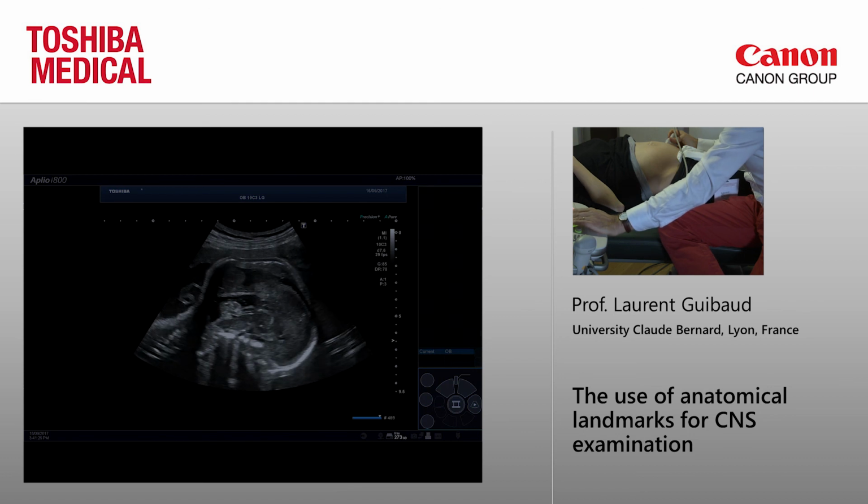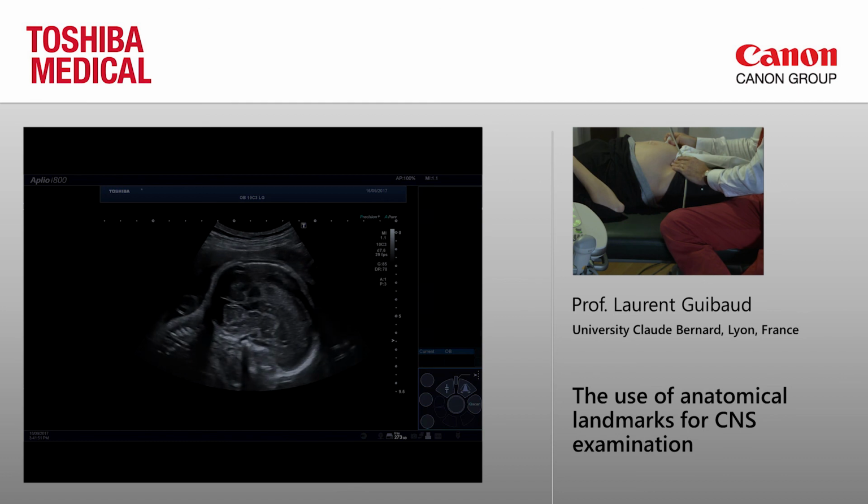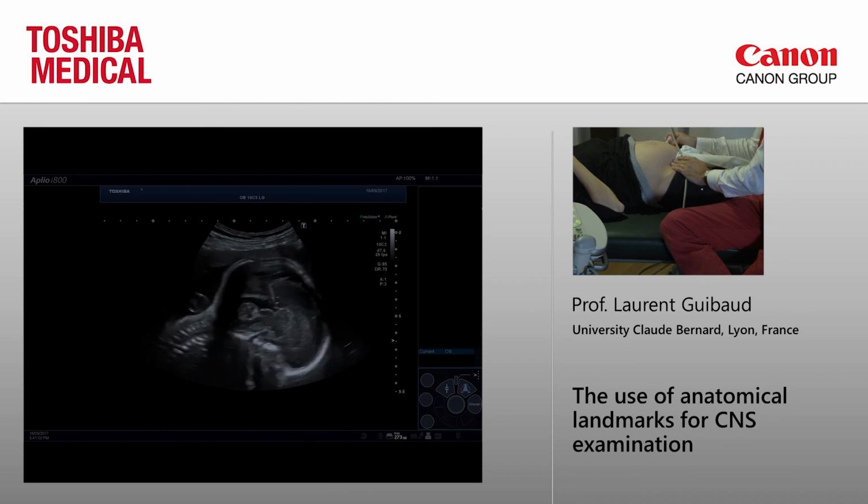Okay, this is the vermis. You see a perfect vermis, and you may also see this, which is the aqueduct. Here you have the pons, the bulb of the pons. You have the tentorium, which is here. And if you look, the echogenicity of the vermis is greater than the hemispheres.